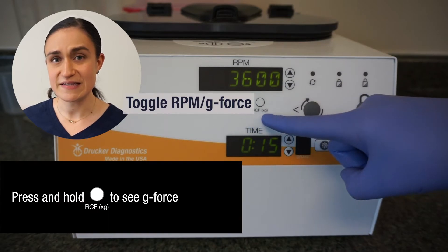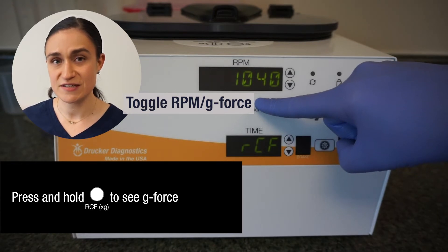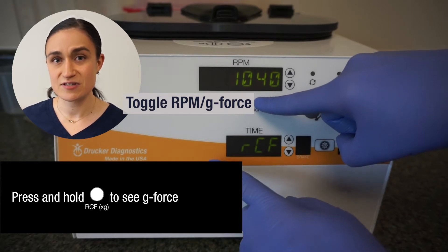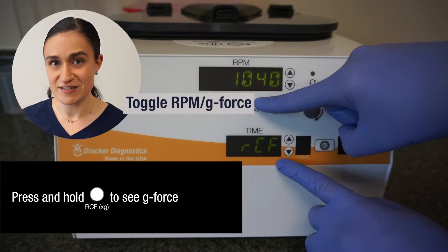Underneath the RPM screen is the RCF XG button. This button will toggle the RPM screen to show G-Force instead. I can tell that it's showing me G-Force because the screen on the bottom will have the words RCF displayed in it.